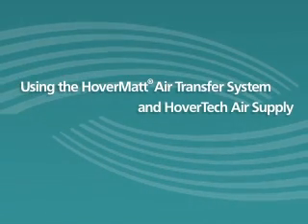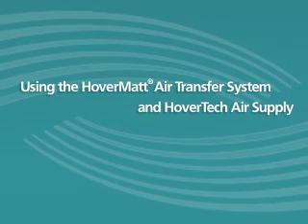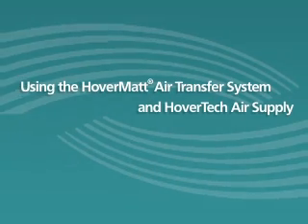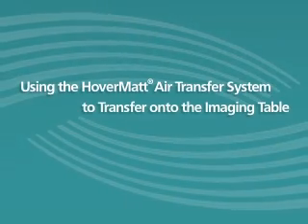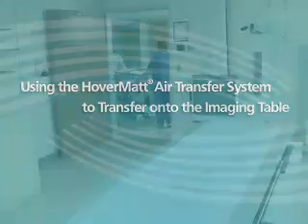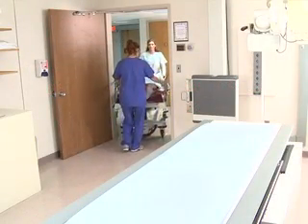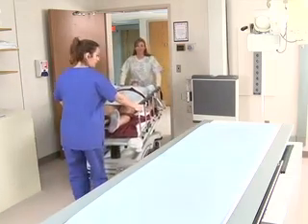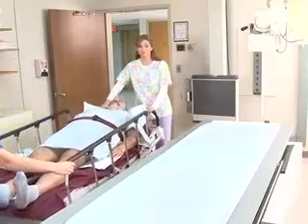Remember to review using the HoverMatt air transfer system and HoverTech air supply video for detailed instructions before using the HoverMatt transfer system. The HoverMatt air transfer system is radiolucent and artifact-free. If a patient is not mobile or requires a great deal of prompting to laterally transfer, he or she can be transported to radiology on a stretcher equipped with a HoverMatt air transfer system.